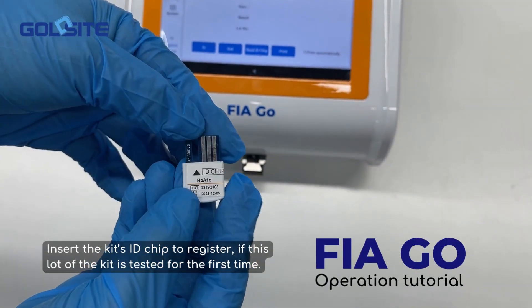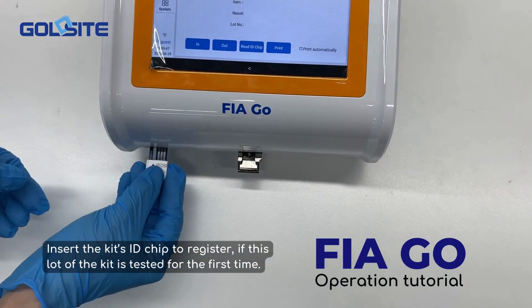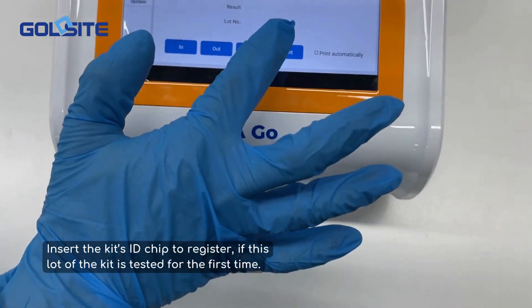Insert the kit's ID chip to register if this lot of the kit is being tested for the first time.